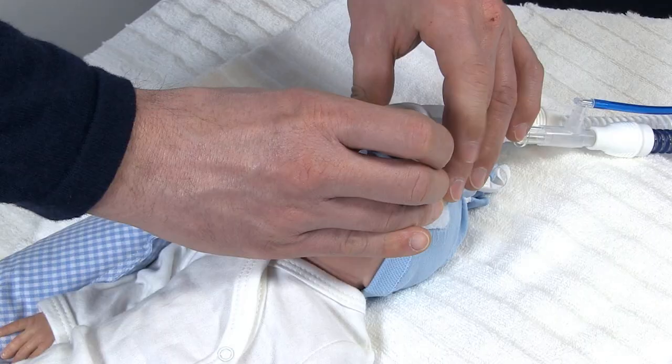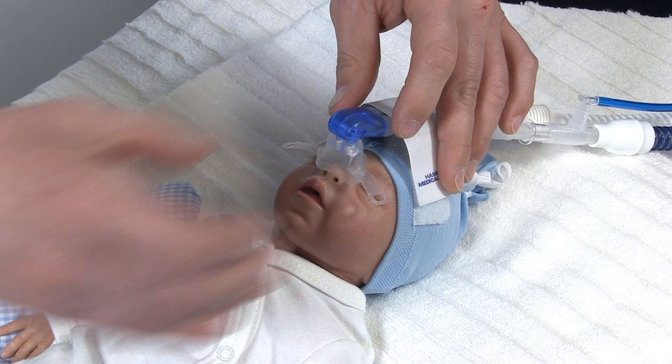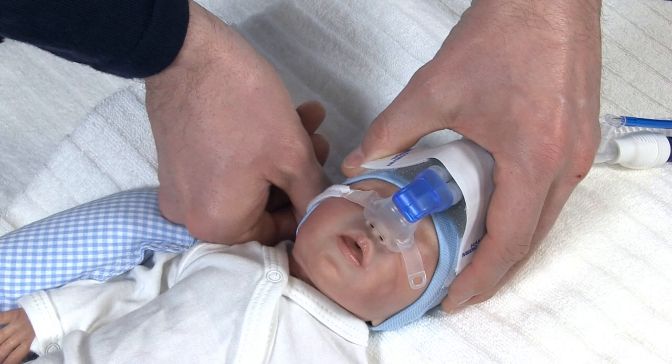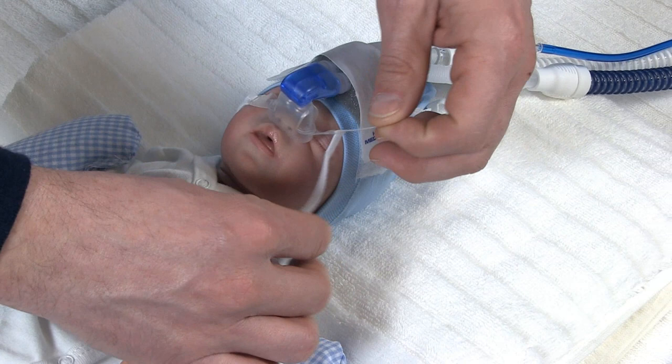Use the fixation straps to hold the mask or prongs in place and to reduce leakage. Mount them in a V-shape on either side of the bonnet. Now check the correct placement of the mask or the prongs.